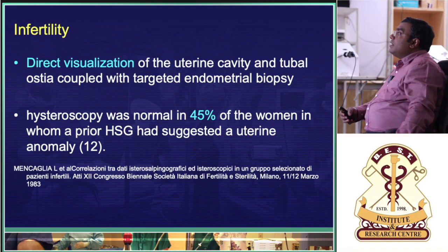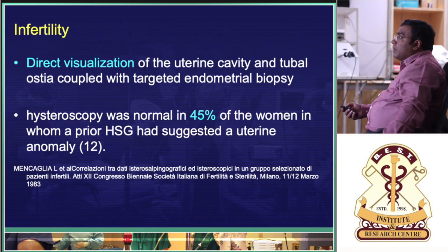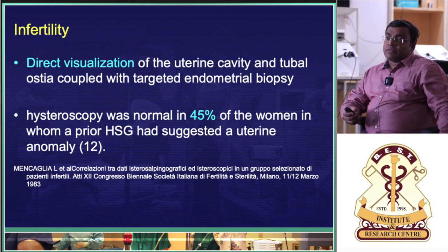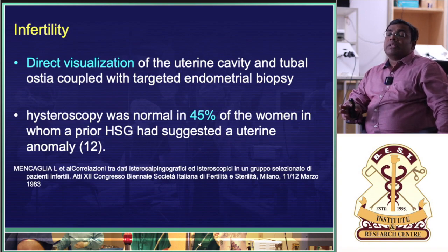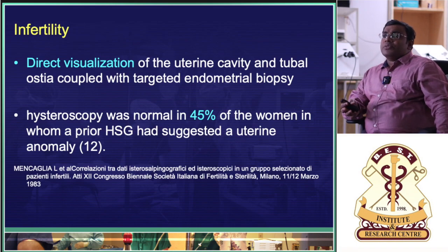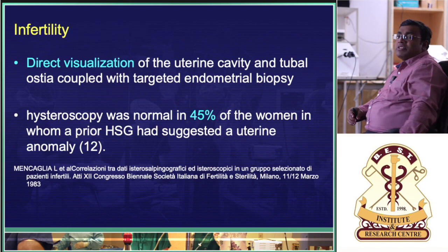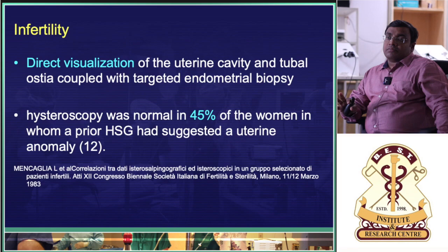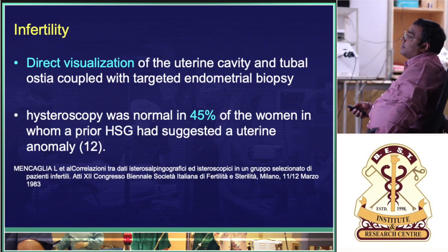Again, in infertility, it's very helpful, and a lot of women undergo hysteroscopy prior to IVF embryo transfer. It's better to do it than have the situation where I have missed a polyp or something which some other doctor finds out. Rather you do a hysteroscopy for all of them, but routine hysteroscopy prior to IVF is not recommended. By guidelines it is not. A lot of people do it, but it's not mandatory.